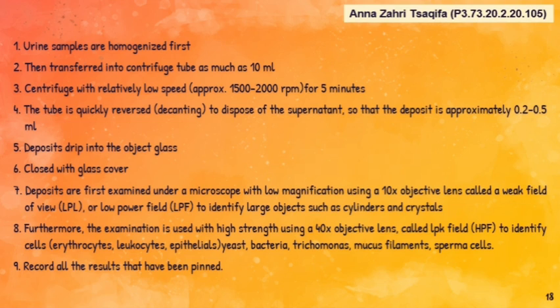5. Deposits are dripped onto the object glass. 6. Close with a glass cover. 7. Deposits are first examined under a microscope with low magnification, using a 10 times objective lens called a low power field (LPF), to identify large objects such as cylinders and crystals.